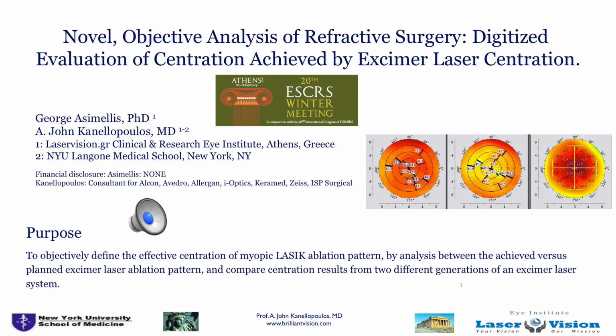We're trying to find from the difference maps, as you can see here in this initial presentation slide on the Pentacam before and after in a myopic LASIK correction, what was the actual effective centration, stratified in a large number of cases, and thus be able to compare two different lasers and the ability to center the ablations, not just as an aim, but as a result postoperatively.